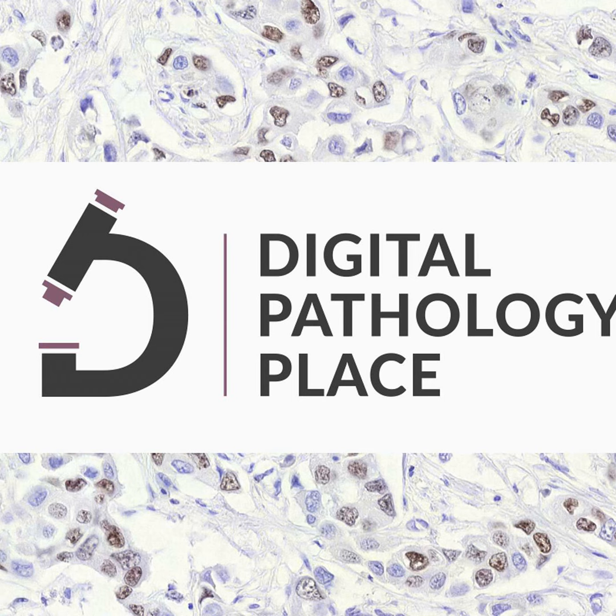I later went to PathXL, where I was Director of Strategy, and there I oversaw the development of a couple of the PathXL products. I'm one of the inventors of a product called TissueMark, which is an algorithm-based detection system for tumour tissue. It both detects the tumour and gives an estimation of tumour content within the piece of tissue on the slide, but that's designed for subsequent molecular analysis. So it's something a little bit different from what we would normally come across with image analysis and AI algorithms in digital pathology.